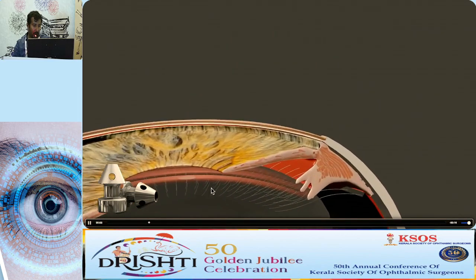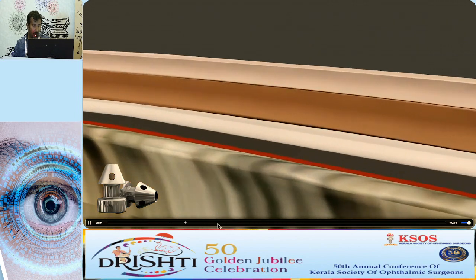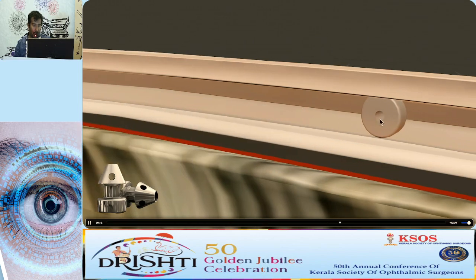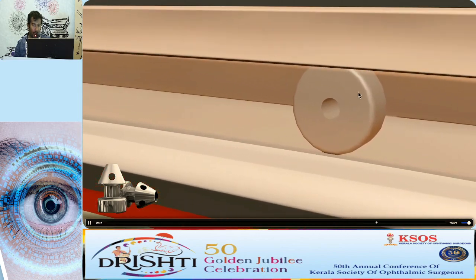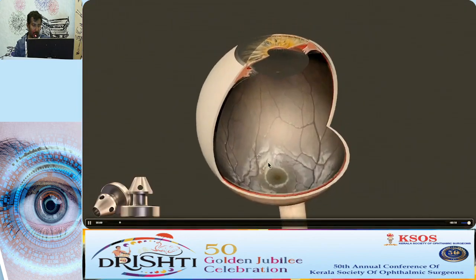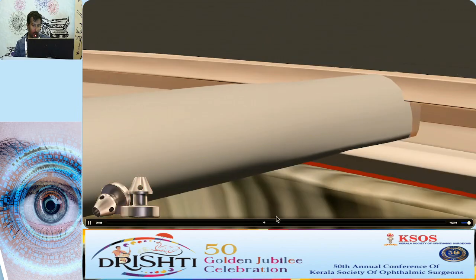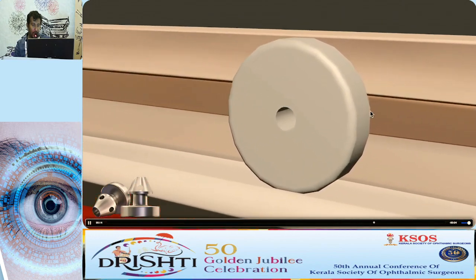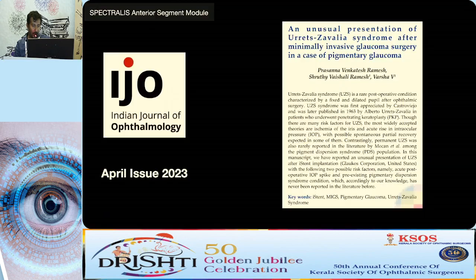If you see, this is the trabecular meshwork, and this is the injector. Once you put it, it goes here. If it is pushed a little more, it can go into the Schlemm's canal completely. So the next version has a wider flange, and after the injector is placed there, the wider flange prevents it from going into the trabecular meshwork too much. Okay.